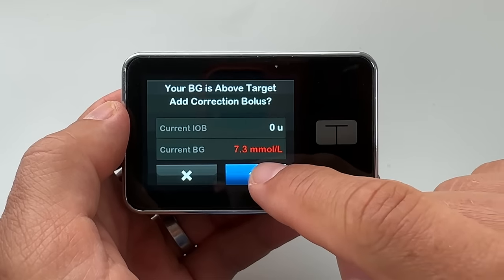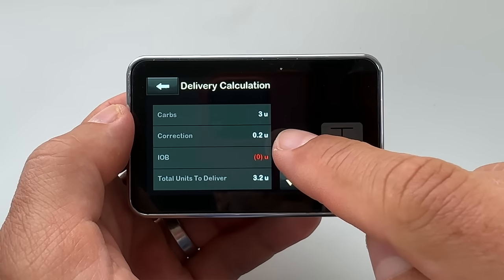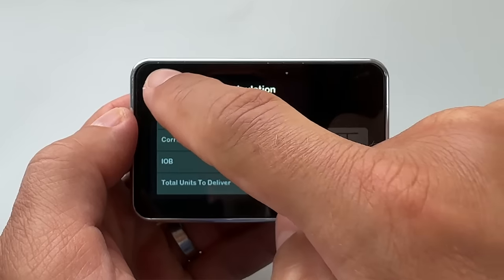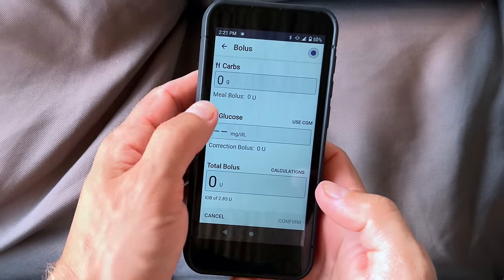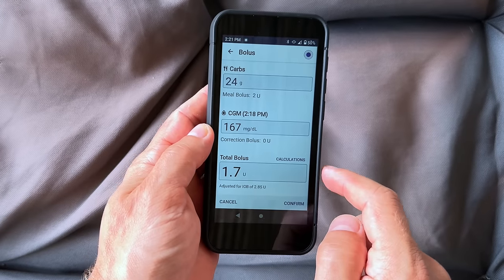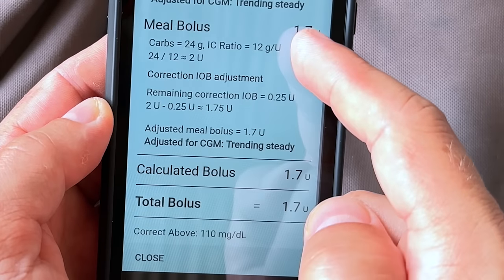The slight advantage of Omnipod 5 is that you can turn on activity mode for a specific number of hours and it turns off automatically. With T-Slim X2 you need to turn off exercise mode manually, and you might forget. The key to success while exercising, at least for me, is to turn on the activity mode well in advance. Now, bolusing is still up to you for pre-meal doses, but both systems have a sophisticated bolus calculator. T-Slim X2 accounts for carbs, applies a correction based on current blood sugar, and considers insulin on board. The Omnipod 5 smart bolus calculator does all this plus looks at your blood sugar trend and 60-minute prediction, automatically adjusting the bolus if glucose is trending up or down. I like that it does a bit of thinking for me.